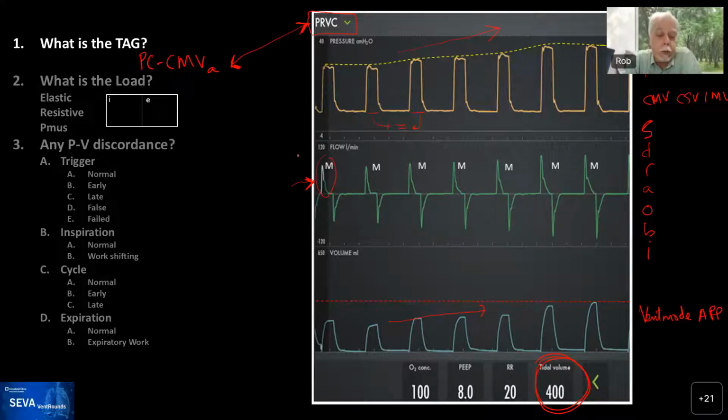Yep. And other manufacturers call it even worse things, like volume control plus. Yes. Well, it's not volume control, it's pressure control plus, if you will. And we have some gifts of that nature in the future here. We'll see. All right. Excellent questions.